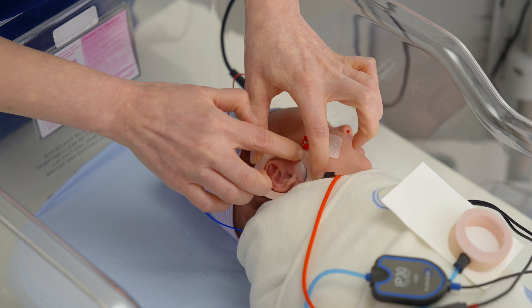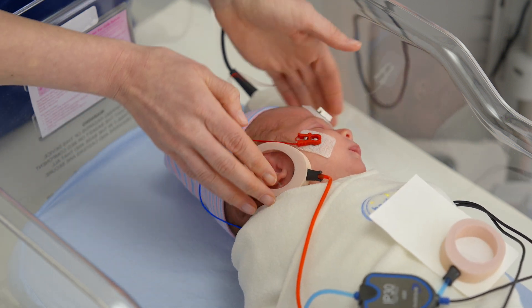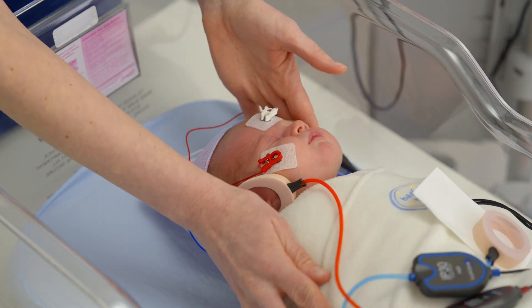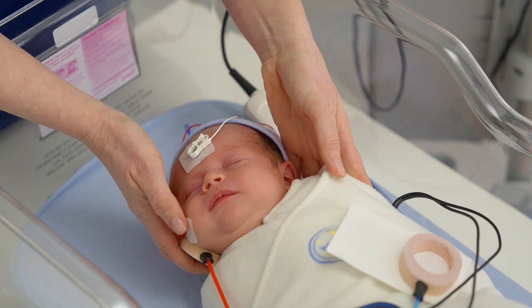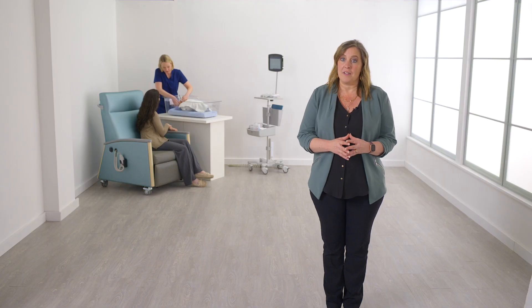If the ear cup is not sealed completely or if the black adapter is partially blocked, the loudness of the clicking sound will be reduced and could cause a refer result. Repeat this process for the left ear by placing the ear cup attached to the blue tubing around the baby's left ear.